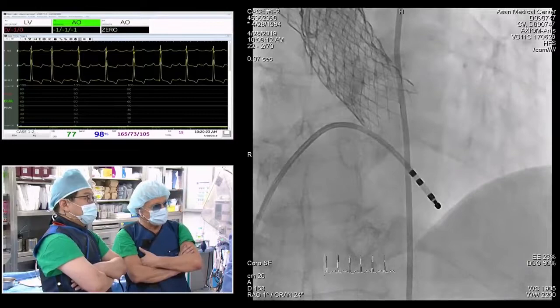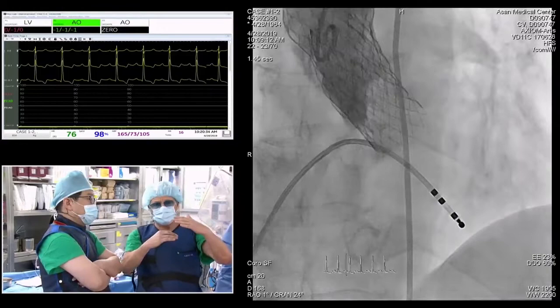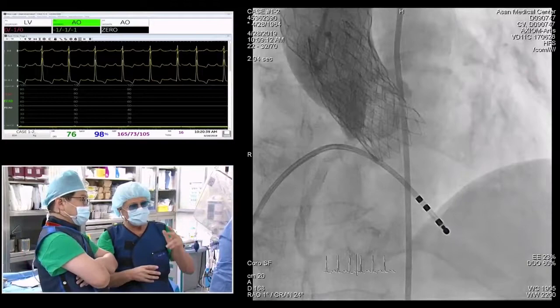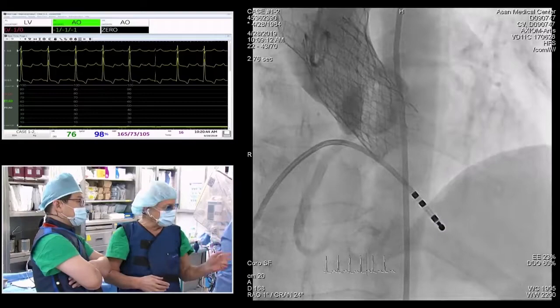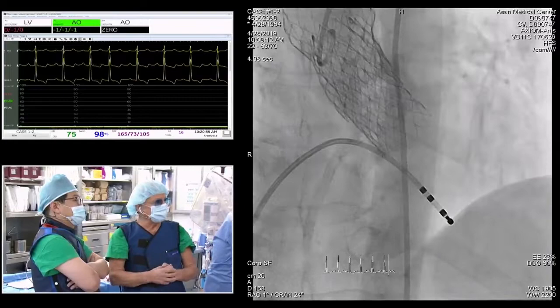Then the patient was getting a little bit antsy. What I tried to do is go between the two valves, underneath the first one and higher up on the second one, into the trough. We only did two attempts because the patient got antsy and moved around, and it was a long procedure. But I'm confident that between the two, he will be able to access the valve in a second session.